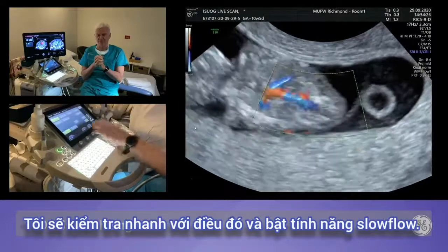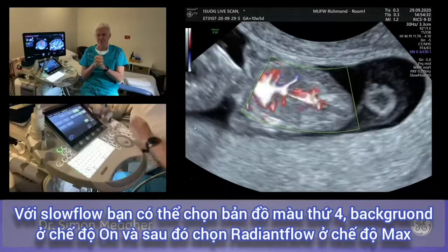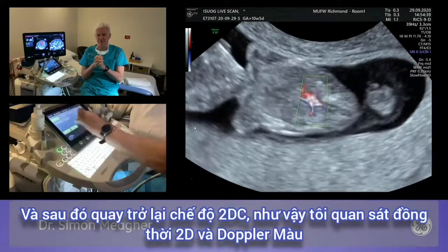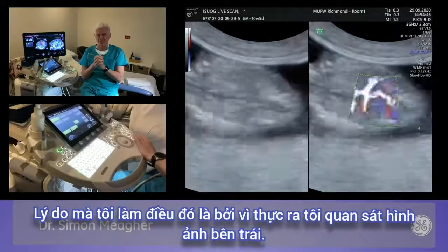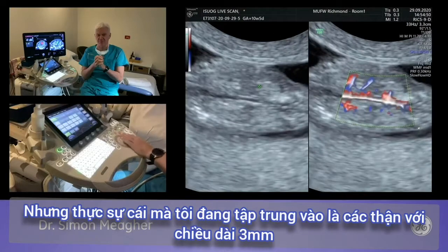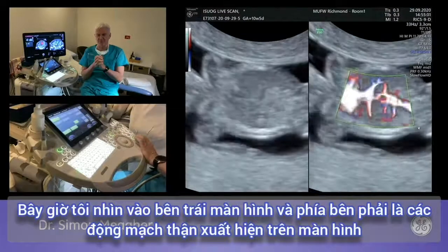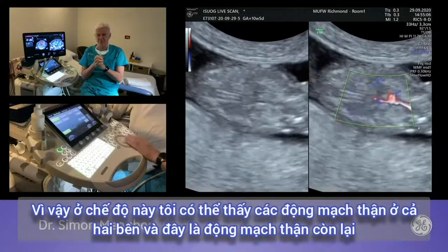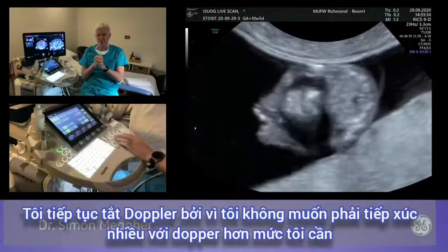Turning on slow flow: select map 4, background on, radiant flow max. Narrowing the color box to minimize exposure, looking at 2D and colour on the left side of the screen where the kidneys are — the kidney measures 3 millimeters in length, and here is the renal artery. Coming across, I can see the renal arteries on both sides. Normal appearance to the renal tract at this early stage. Colour off to minimize exposure.